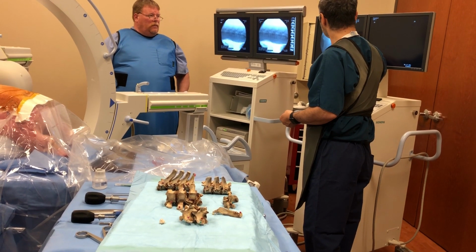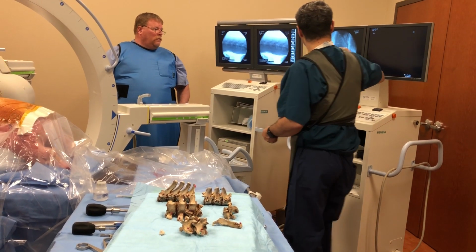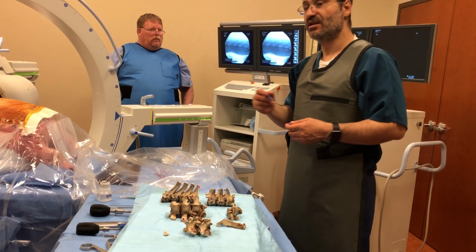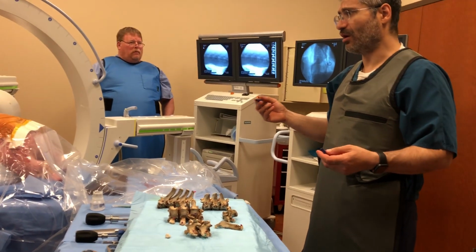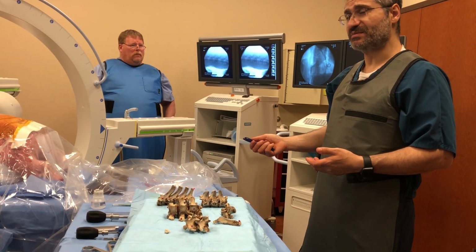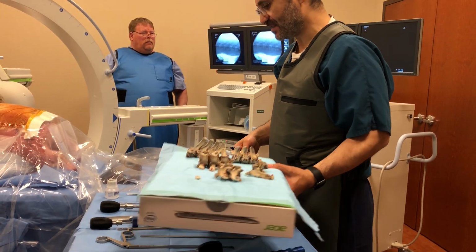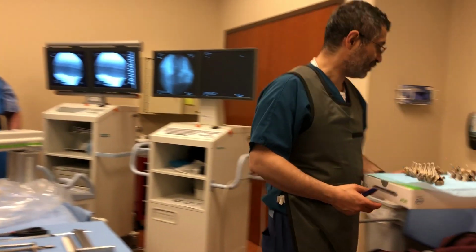You aim for the lateral approach, and you make sure by the time you pass the pedicle here, you haven't reached the medial wall of it. So that's for posterior, and that is more or less part of OLIF. At least we advertise it as MIS posterior pedicle screw placement, which can be done effectively and less invasively.